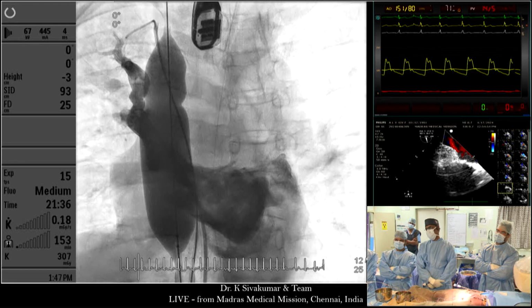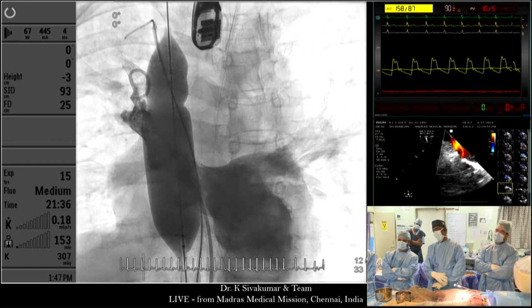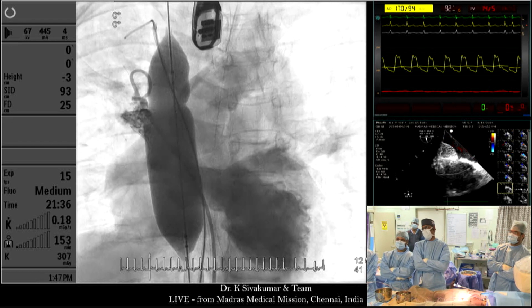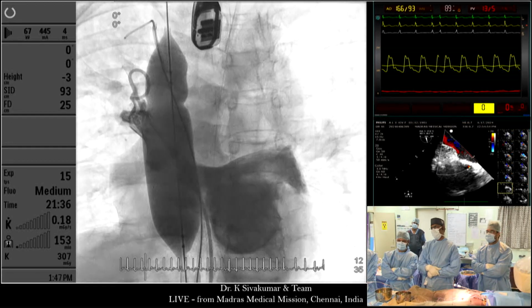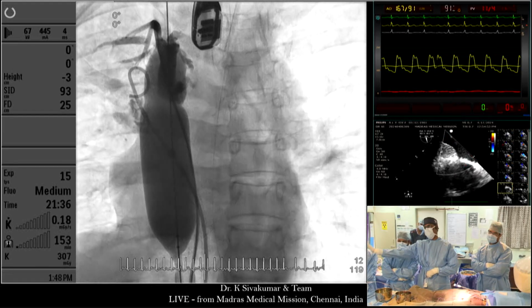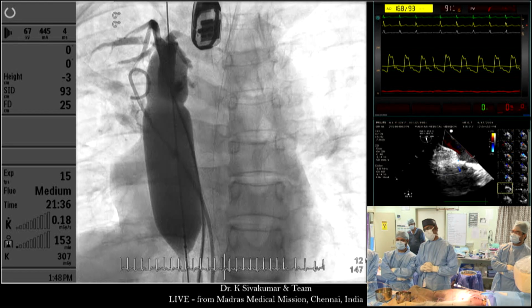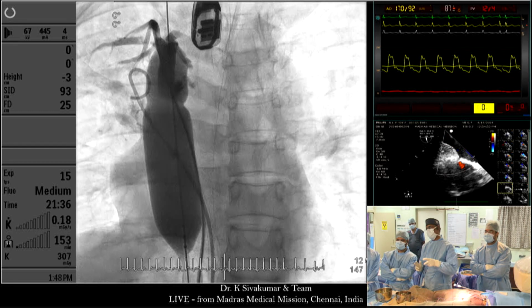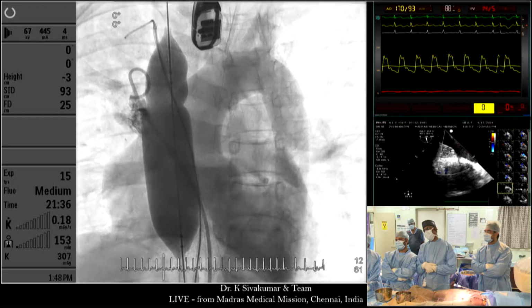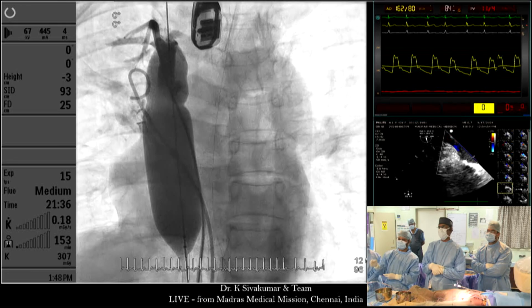Go further. We can see the full left atrium getting filled, and the left pulmonary veins getting filled. There is no residual flow into the right atrium at this point. Now the LV and aorta keep filling. Towards the end of this injection, I inject into that additional pulmonary vein. Freeze. This additional right pulmonary vein is getting occluded by this balloon, and as I deflate the balloon, we can see that this pulmonary vein now drains into the superior vena cava. Keep running.